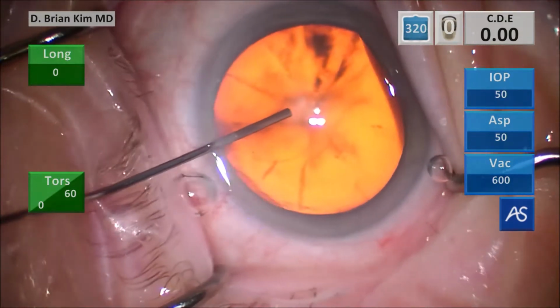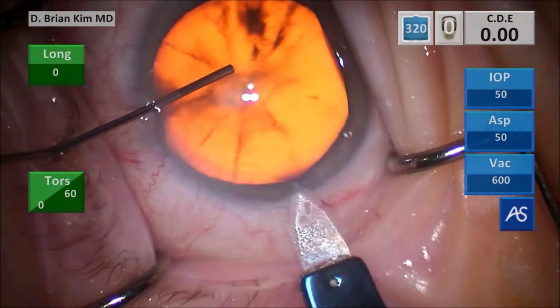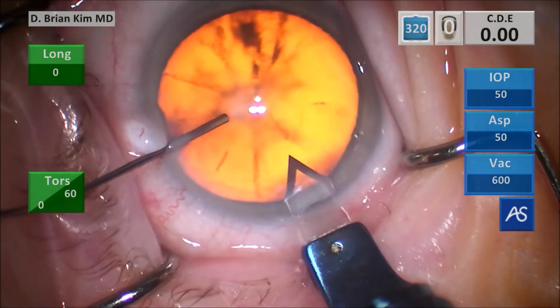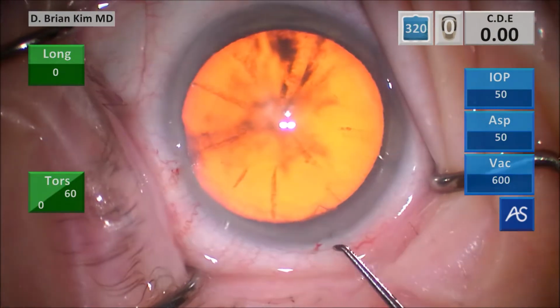I use a cannula to hold the eye and control the eye, and this is a triplanar corneal incision. I make a vertical groove, place the blade into the deep part of the groove, tunnel, and then enter. I push some more viscoelastic at the end, and this is the puncture style rhexis.